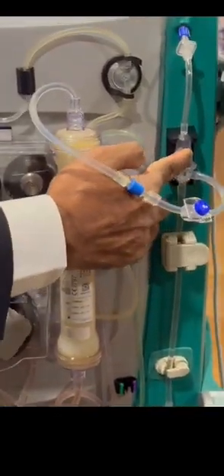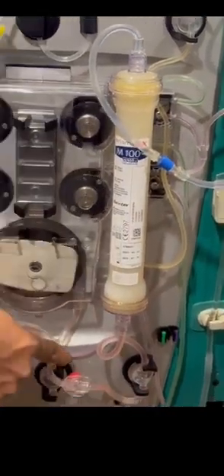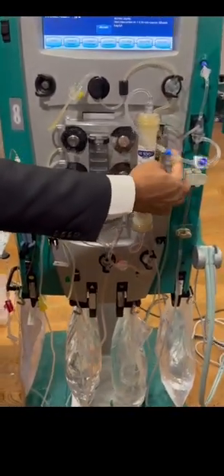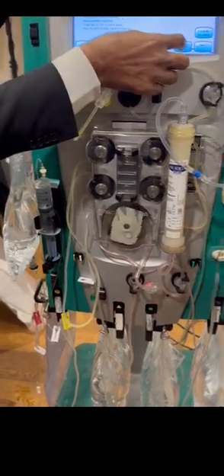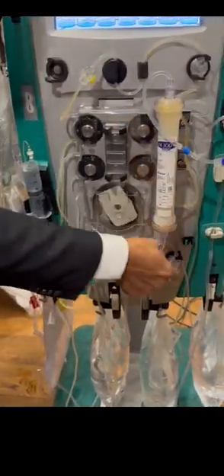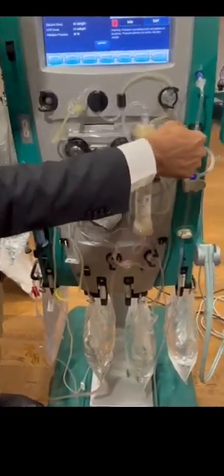This is post replacement. If this is coming here, it is pre-replacement. Just remember, I will tell how we are moving post, and usually, if we are using this pre-replacement line, we always keep this as a post replacement. Okay, so this is done.